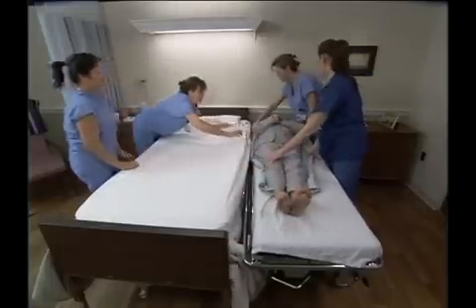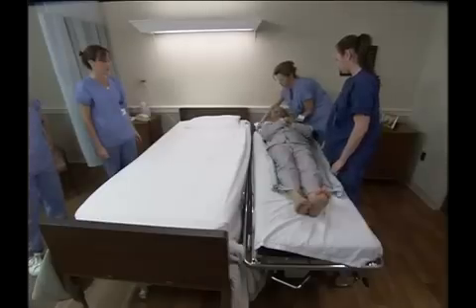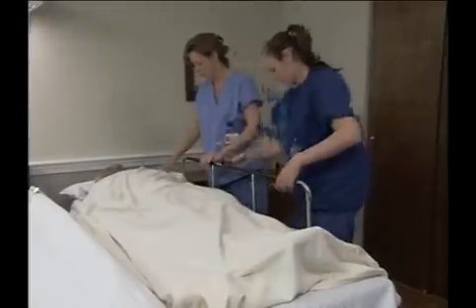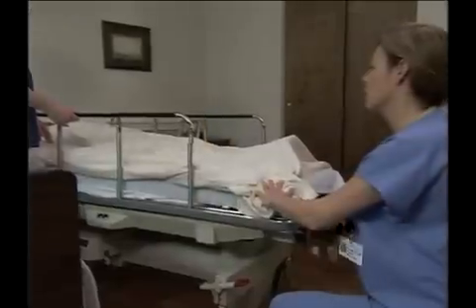Next, position the person on the stretcher and make sure he is in good body alignment. Reposition the pillow under the person's head and drape him with a blanket for modesty and warmth. If necessary, buckle the stretcher safety belts across the person and raise the side rails on the stretcher. Raise the head of the stretcher as the person requests.